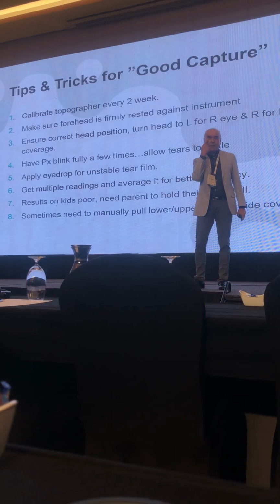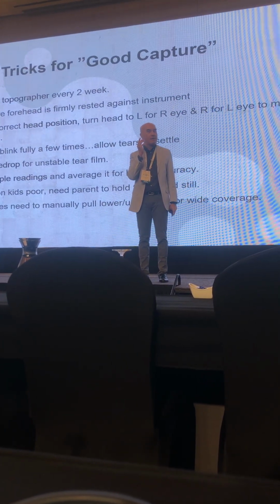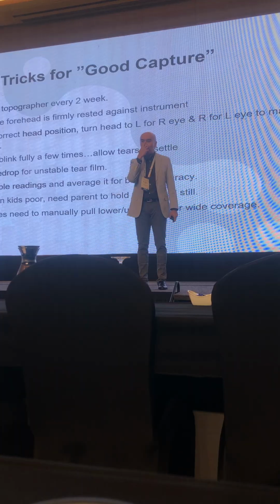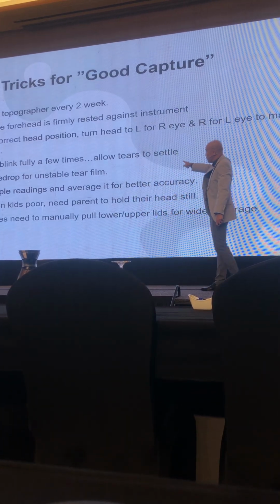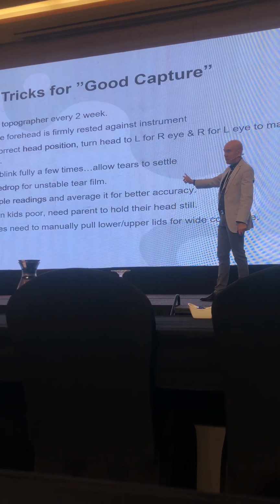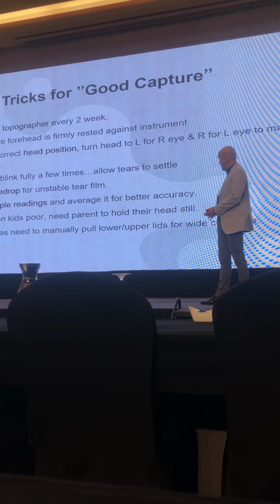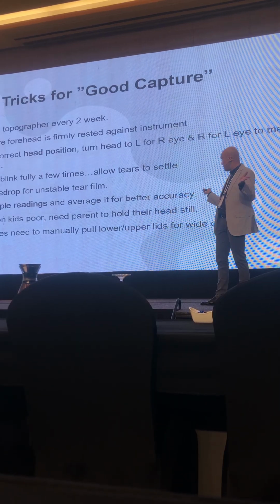If you want to take the right eye image, tilt to the left, so that the high nose bridge won't block the view. Also, ask the patient to blink a few times, open, and then capture. Why? Because you need a very stabilized tear film in order to get a good image. And get multiple images and average them.